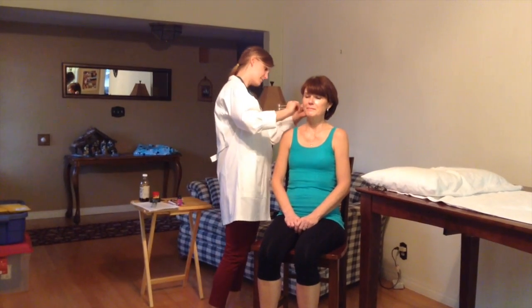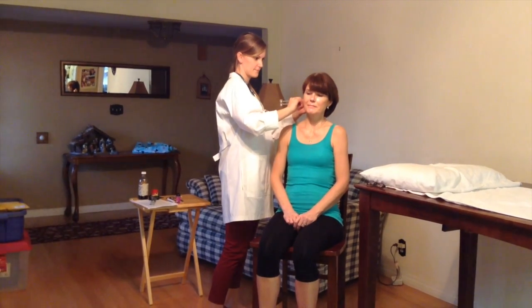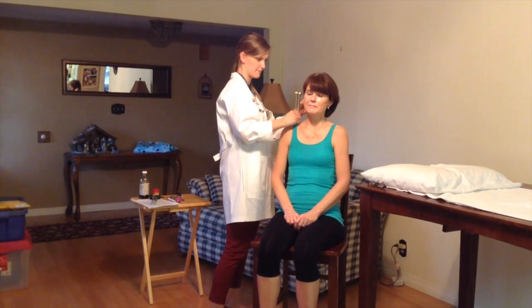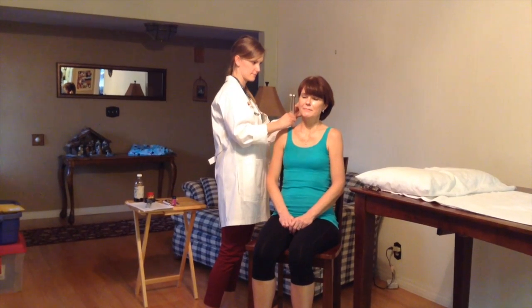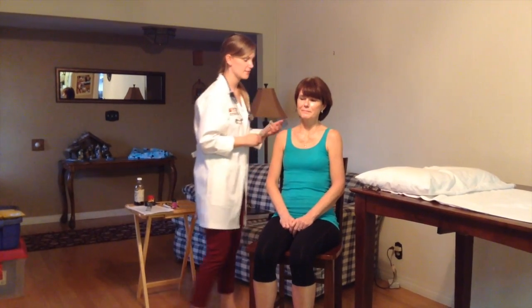Now I'm going to do another test called the Rinne test. I'm just going to have it vibrate on your mastoid bone, and you let me know when you stop hearing it, okay? Okay. Hear it again. Mm-hmm. Let me know when it stops. Okay. Excellent. So about twice as long. Do the other side. Okay.